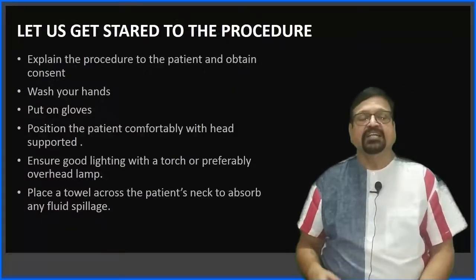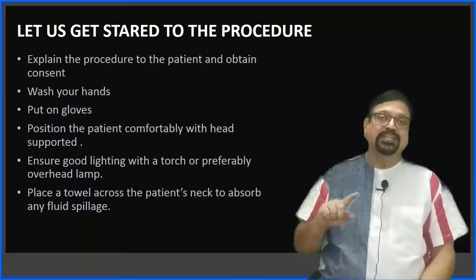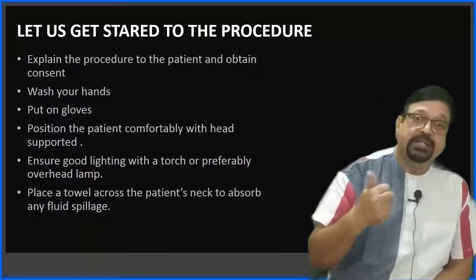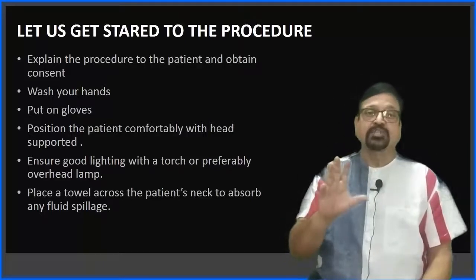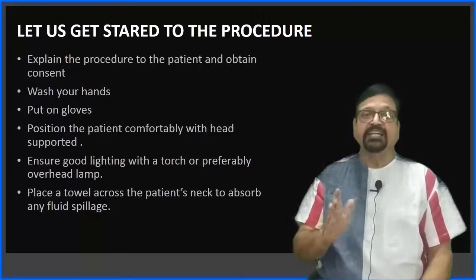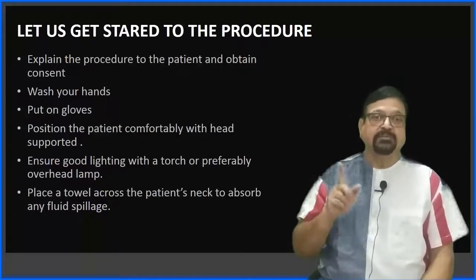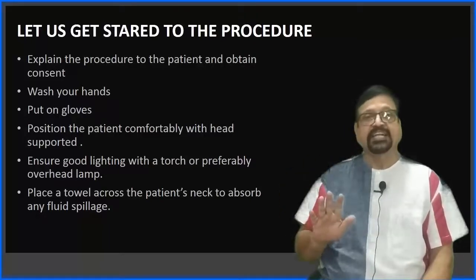Now let's get started. When you get started, what is the first thing always we do in radiology is explain the procedure to the patient. Patient needs to be explained the procedure. Why we should explain it? That is because patient cooperates you better if you explain this to the patient. If patient knows the procedure, he knows what is going to be pain factor, he knows when pain is going to be there, patient cooperates and we don't have any problem.